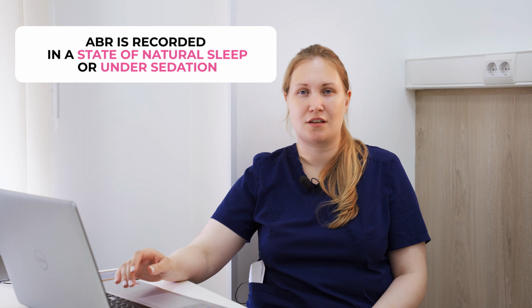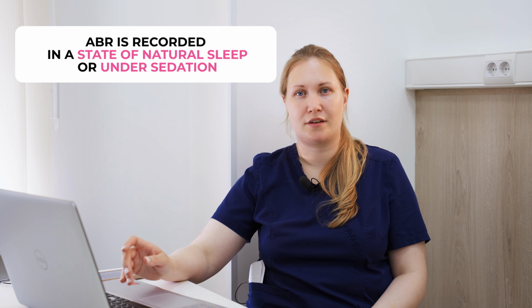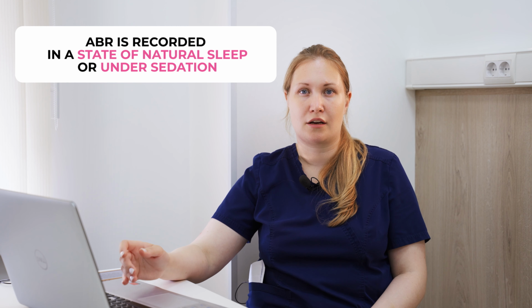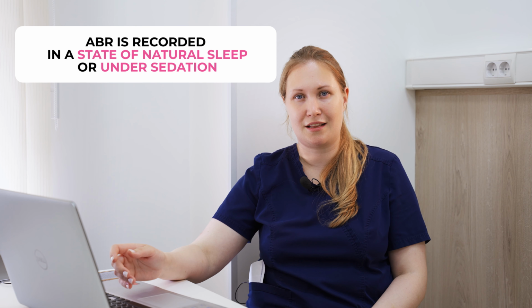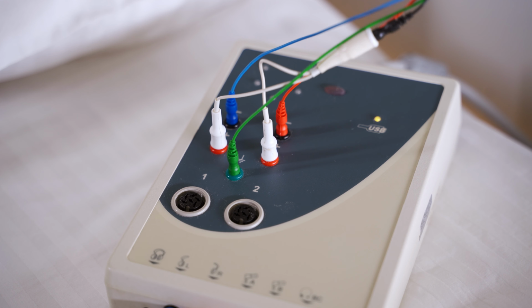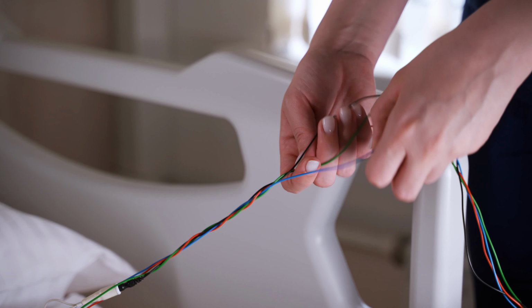In young children, ABR recording should be performed in a state of natural sleep or under sedation, because short-latency auditory evoked potentials are very low-amplitude responses from the subcortical structures of the brain. To separate these signals from the background EEG noise, special conditions must be created under which any motor activity is minimized, even limb and eye movements.